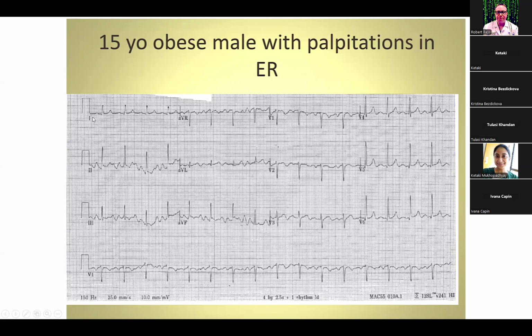We can see clearly in lead 1, which is typically reading a similar vector to V6, that there is a clear P wave followed by a QRS and a T wave, and it clearly looks like sinus rhythm. But despite that, simultaneously in leads 2 and 3, we see this thing that looks something like a sawtooth pattern, but in retrospect has to be artifact because the other lead is so perfectly clearly in sinus.